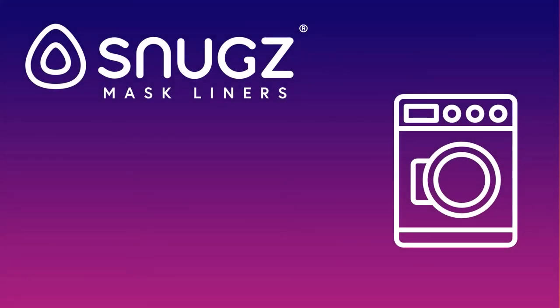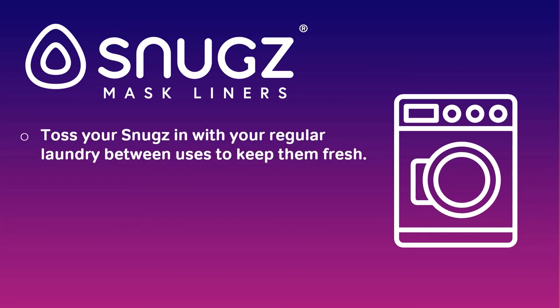We recommend washing Snugs between each use to keep them fresh and free of oil, dirt, and makeup. But with Snugs, that's easy — simply toss them in your washing machine. Just steer clear of any harsh chemicals like bleach.